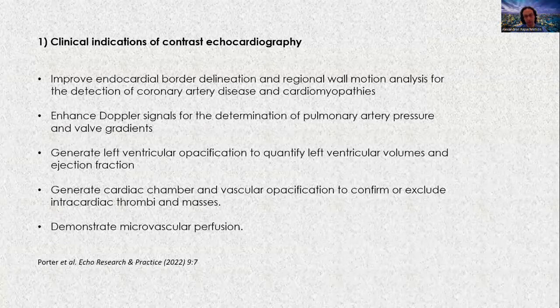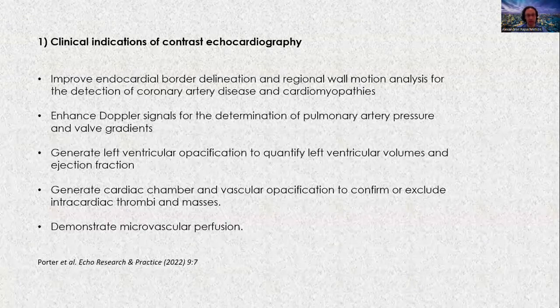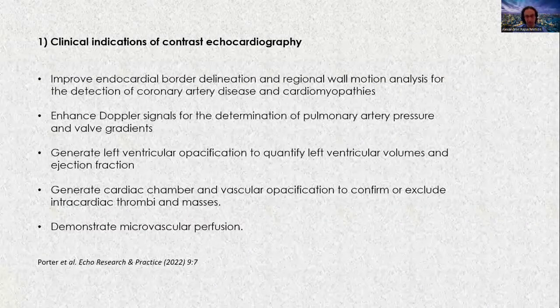Number four, we use contrast to generate cardiac chamber and vascular opacification and confirm or exclude intracardiac diagnoses. And finally, to demonstrate microvascular perfusion.